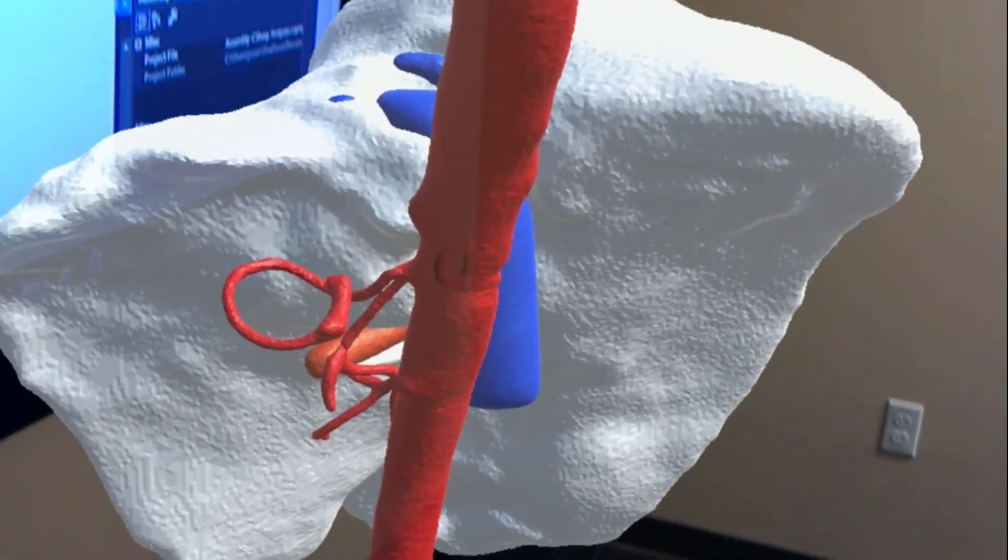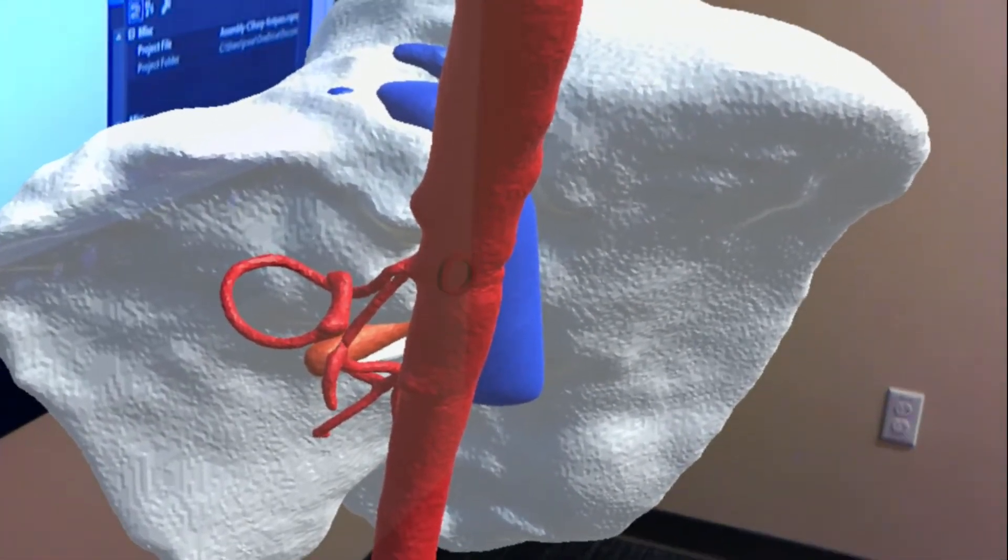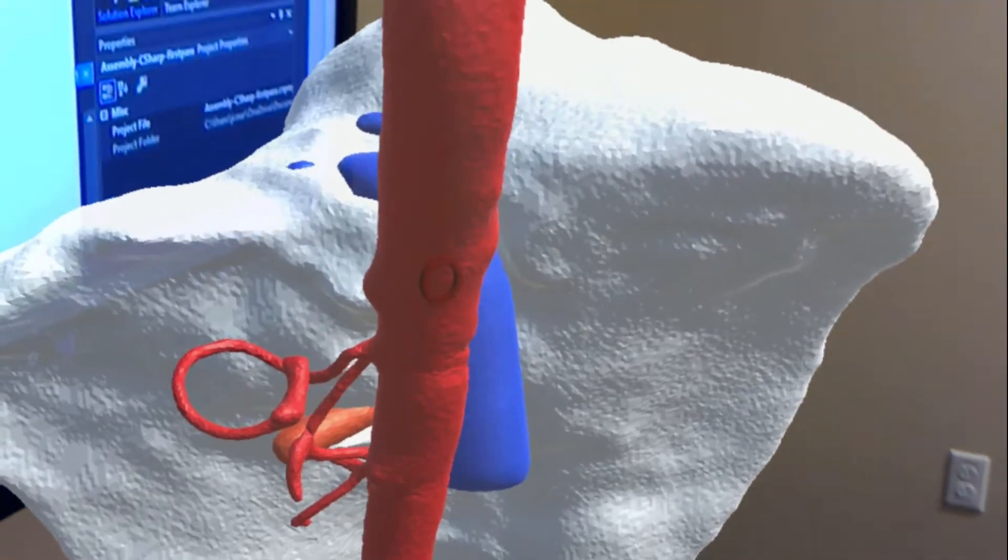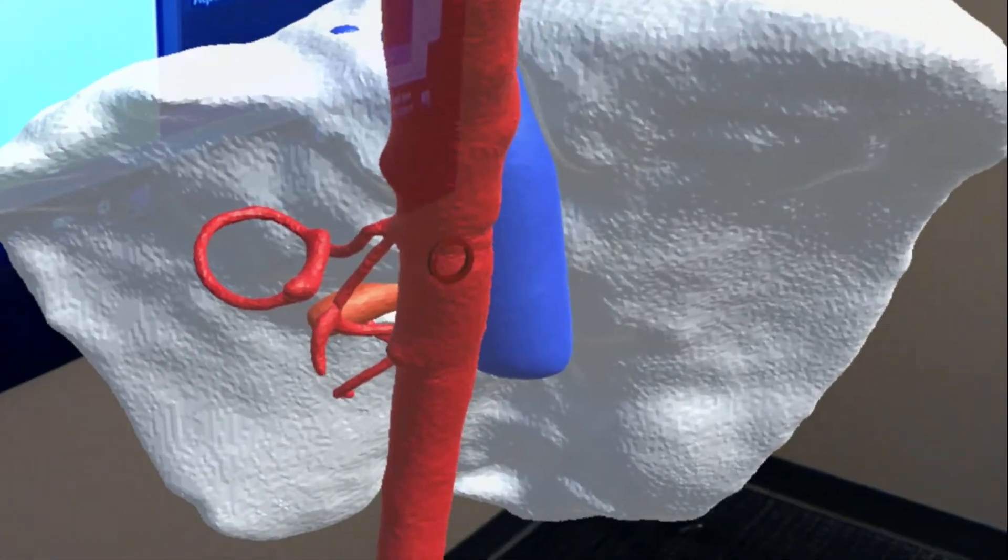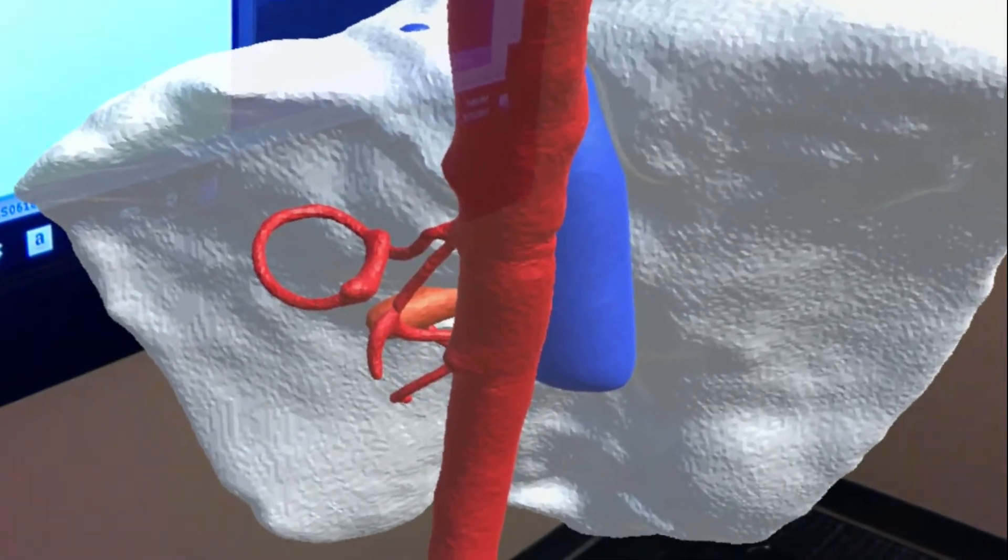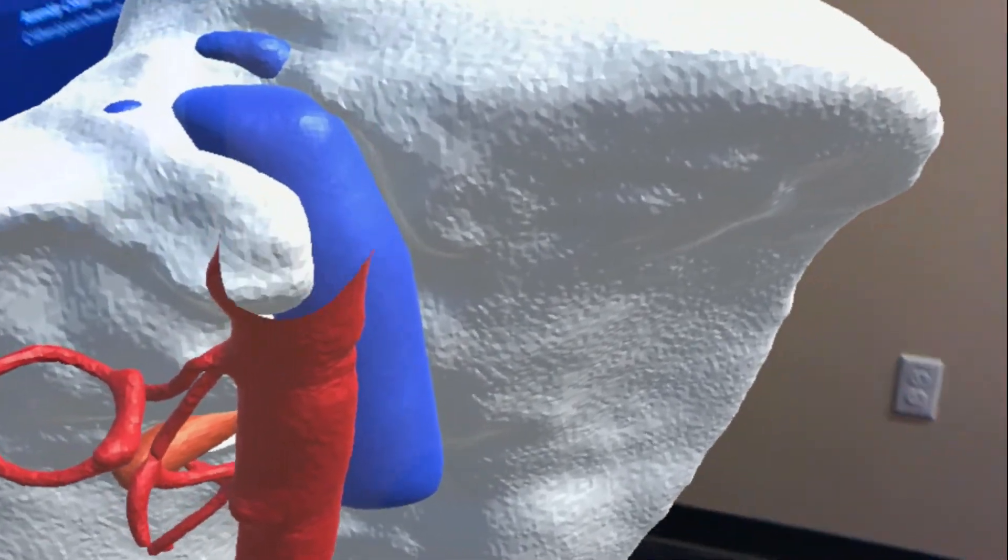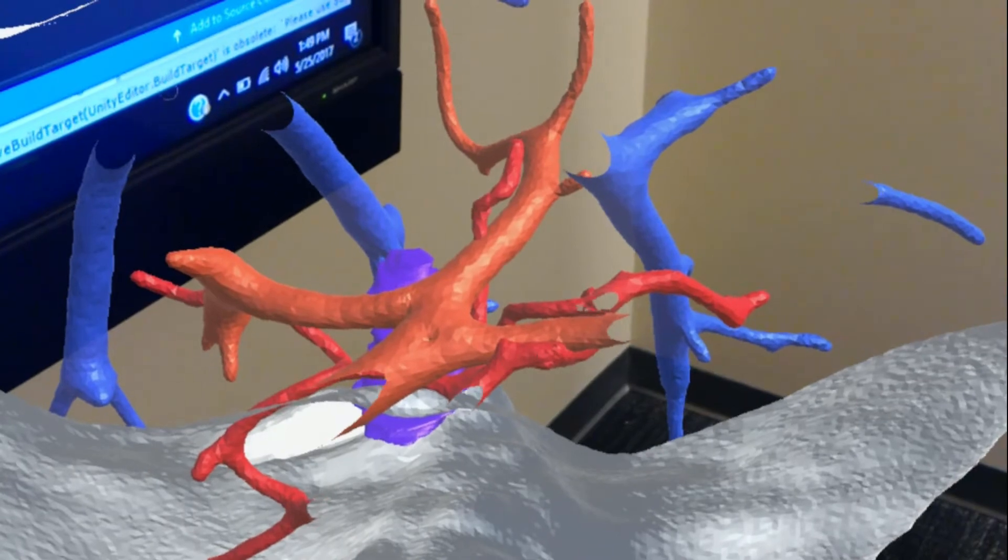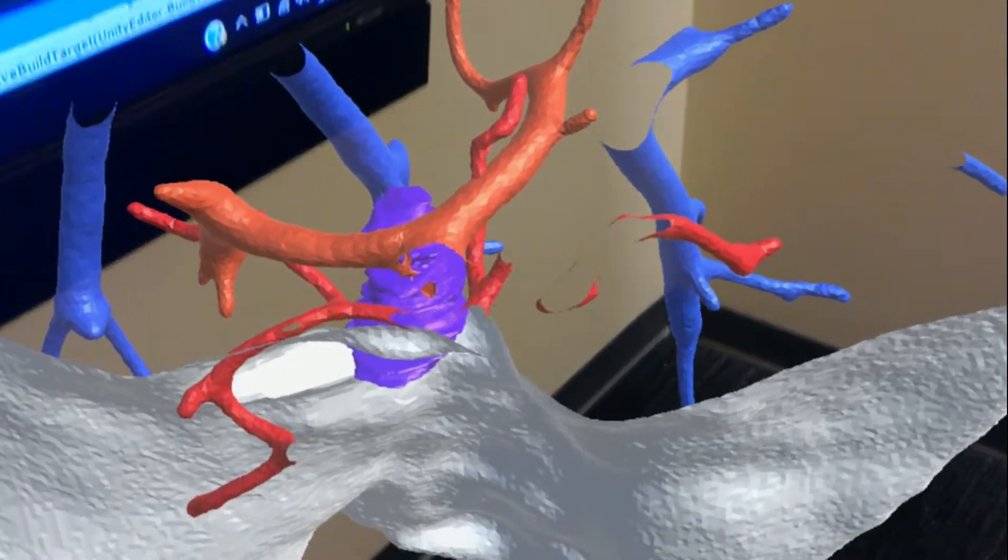We can see the artery that is red, the IVC that is blue. And as we walk through, we can peel away these layers and see inside that there is a tumor that is purple.